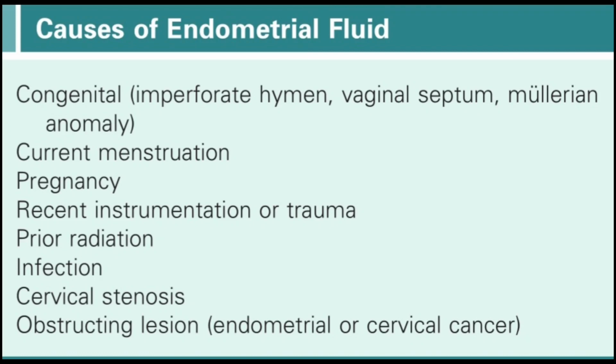In case of cervical stenosis, if there is cervical stenosis due to any reason, maybe because of cancer, tumor, polyps, or radiation, if the cervical area is stenosed and the internal or external os is closed, there will be fluid collection within the endometrial cavity and you will see endometrial fluid on the ultrasound imaging.